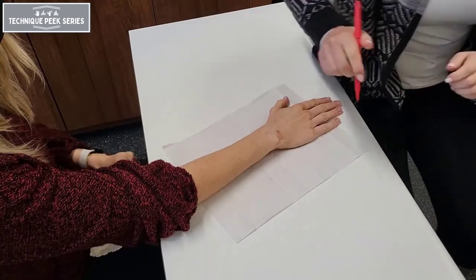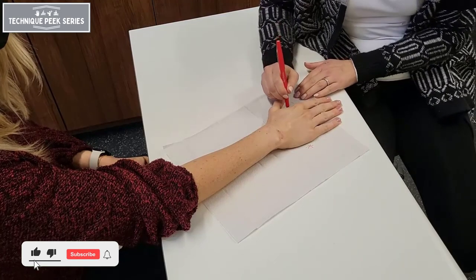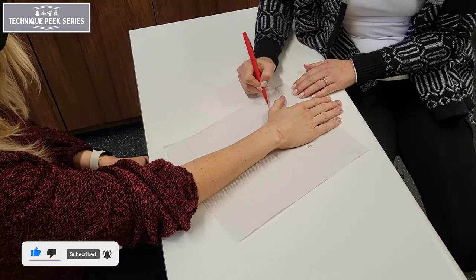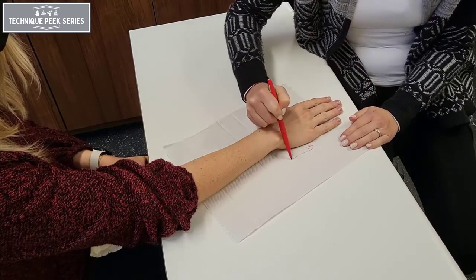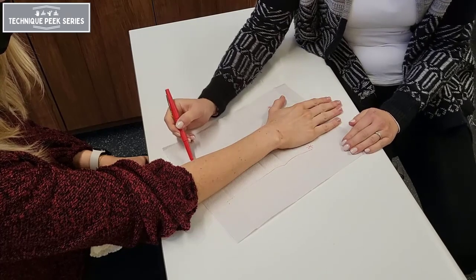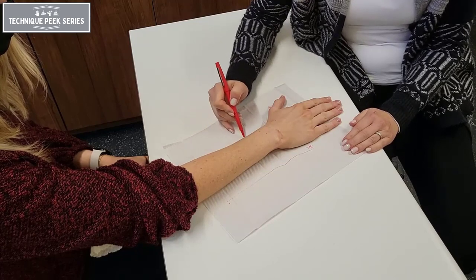Today we're going to see how to make a thumb spica splint, starting with the pattern. We're going to mark the distal palmar crease, then mark the IP joint of the thumb, and then trace a line down two-thirds the length of the forearm, being sure to slightly angle the pen outward to create enough width for the splint.